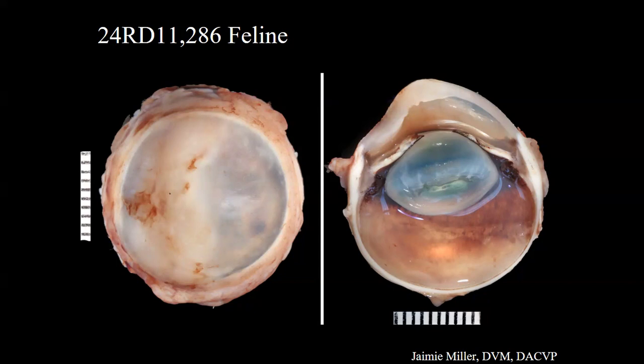After treatment with topical steroids for 1 week, that was also following the tacrolimus, the eye broke out with multiple corneal ulcerations and profuse mucoid discharge. Plus the growth of said mass did not significantly change in size. So they discussed their options and the owner elected enucleation.